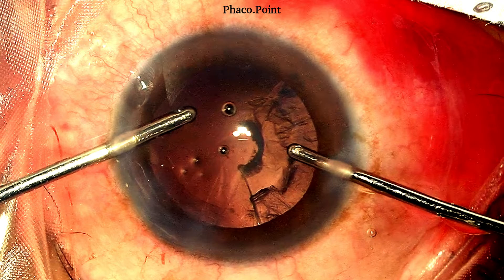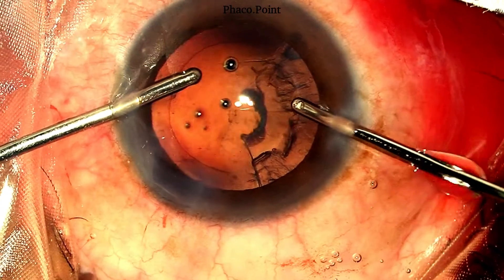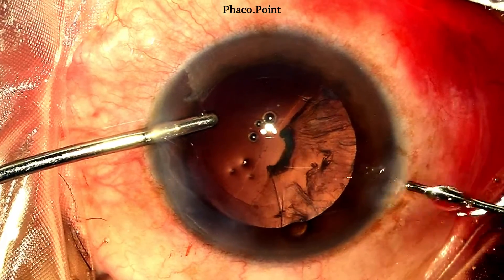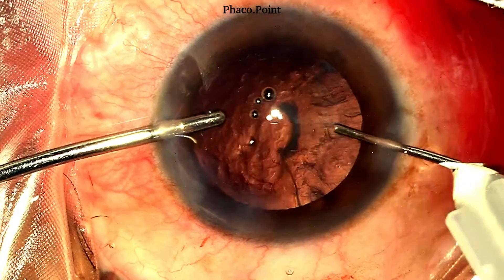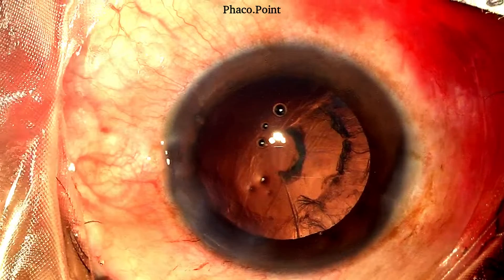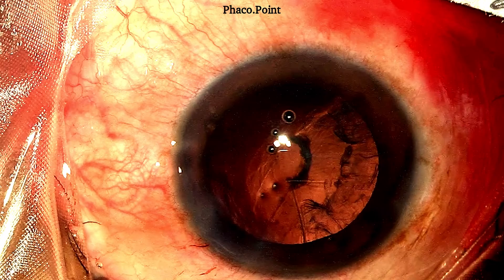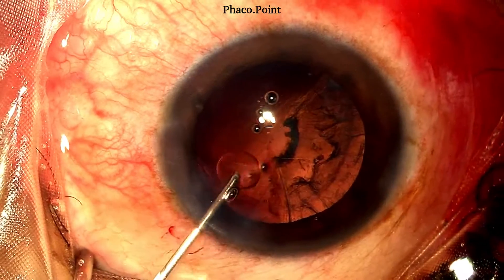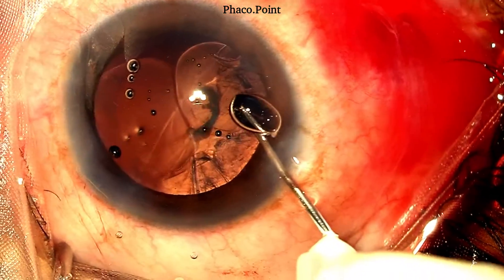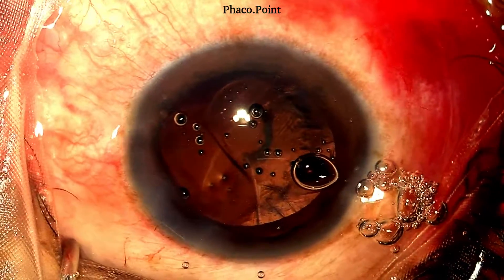The first thing we need to do is not bring our instruments out of the eye. Remove the aspiration cannula and perform a visco fluid exchange prior to removing the irrigation probe from the eye — this prevents vitreous from prolapsing forwards. Following the visco fluid exchange, the irrigation is removed from the eye. When we visualize the posterior capsular rupture now, we can see there is no splaying open of the ends of the PCR, suggesting the vitreous face is still intact. A dispersive viscoelastic is then injected into the anterior chamber to further prevent vitreous prolapse.